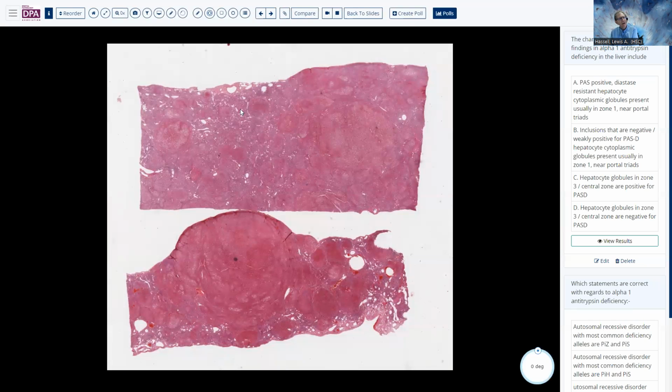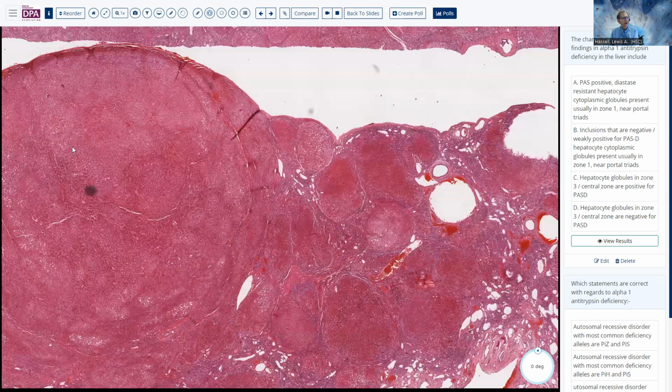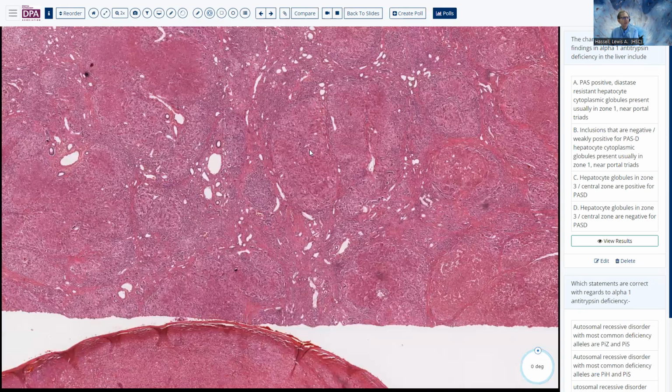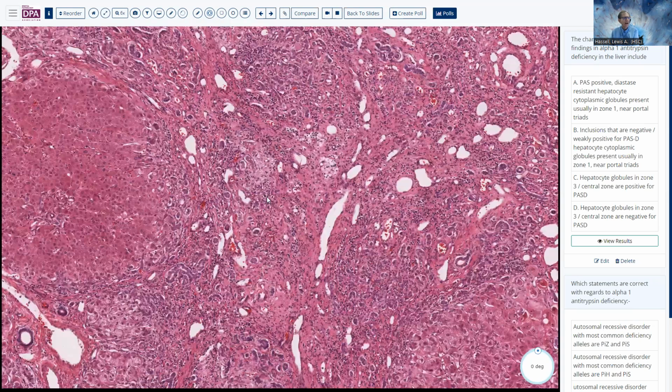Okay, so staying nearby in the liver, we see a fair number of transplants. And it's really amazing to me how many patients are not completely worked up when they come to liver transplant. So here's a patient with a nodular cirrhosis. As you can see, we've got a regenerative type nodule here, other more diffuse type nodules here with biliary ductular proliferation, fibrosis. Not a lot of remaining inflammation here. As you can see, there's not a lot of active inflammation remaining in this situation.